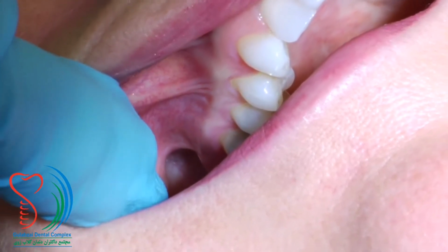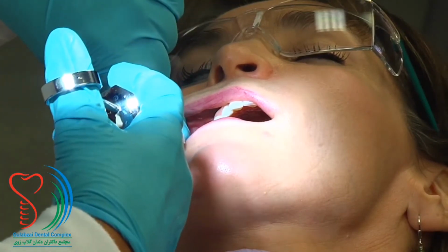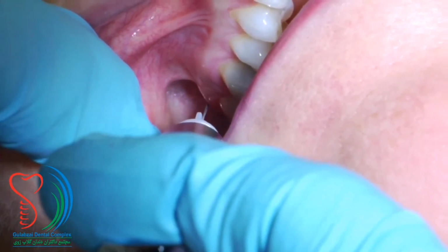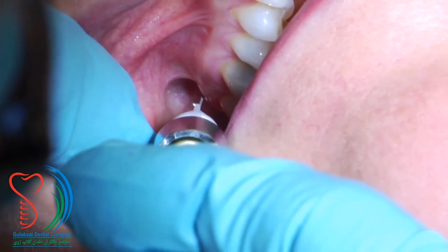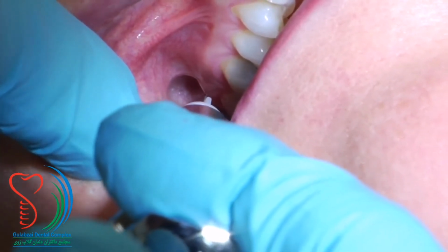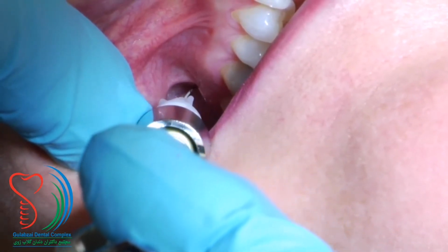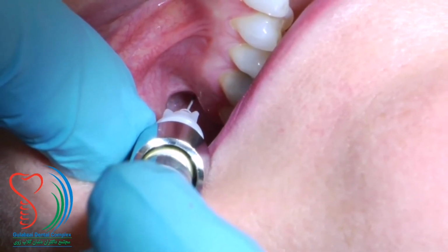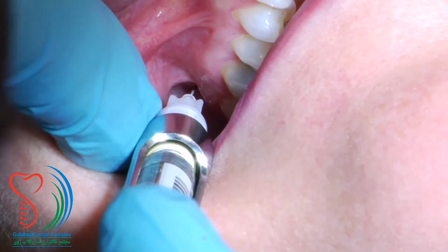direct your needle. The needle penetration site is into the tissues at the height of the mucobuccal fold, at the apex of the second molar, distal to the zygomatic process of the maxilla, inserting upward and inward to conform to the tuberosity. The angle of needle insertion is upward at a 45-degree angle to the occlusal plane, inward behind the maxillary tuberosity at a 45-degree angle to the mid-sagittal plane, then backward at a 45-degree angle to the long axis of the maxillary second molar.